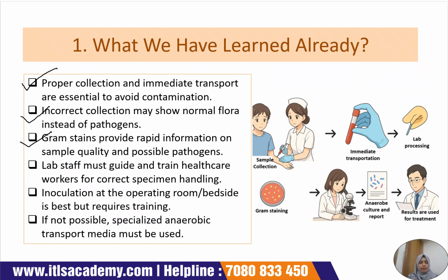Okay. And the fourth point, what we have learned is lab staff should provide proper training and guidelines to the healthcare workers on how to correctly collect and handle specimens. Fifth point, what we have learned is the best practice is to inoculate the sample directly into the culture media at the operating room or bedside, but this requires adequate training of the staff.